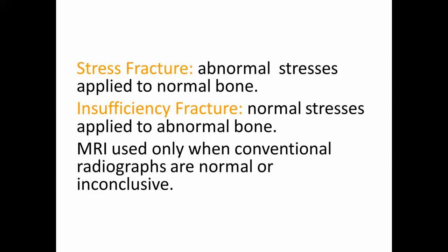The fracture here is due to insufficient bone matrix, that means osteoporosis or osteomalacia. So to put it together, stress fracture is an abnormal stress, a fall for example, on a normal bone, while insufficiency fracture is a normal stress, walking for example, in patients with osteomalacia or osteoporosis. The MRI is used only when conventional radiographs are normal or inconclusive.